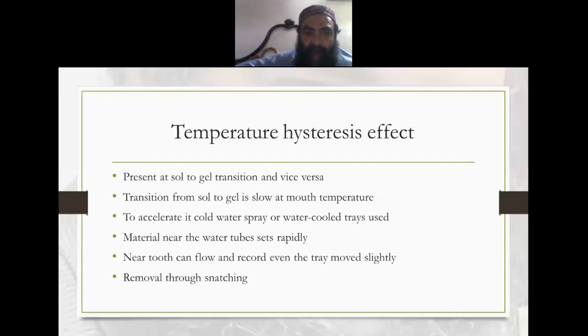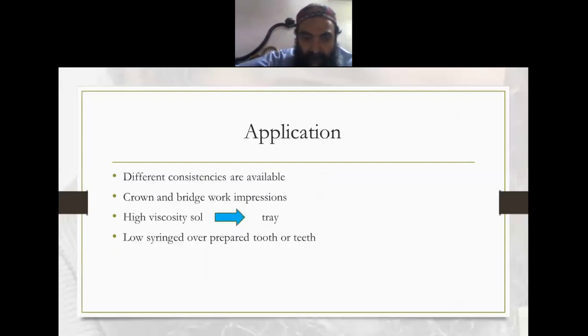And the impression tray, if we are using a single technique, then the other consistency, which is thicker, more viscous, is loaded into the tray, and then the tray is applied over the tooth or teeth for which we are going to take the impression.